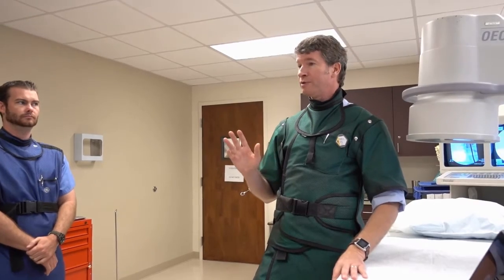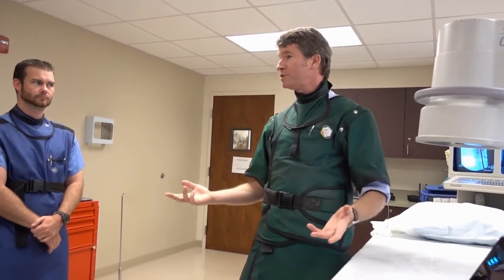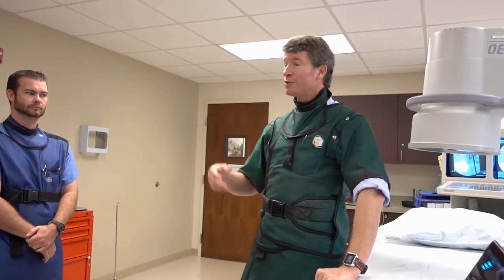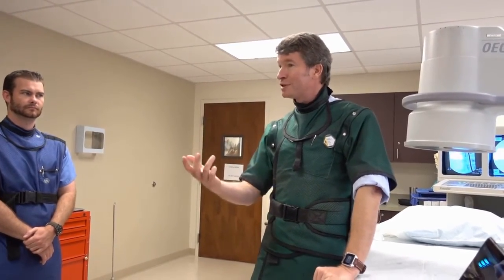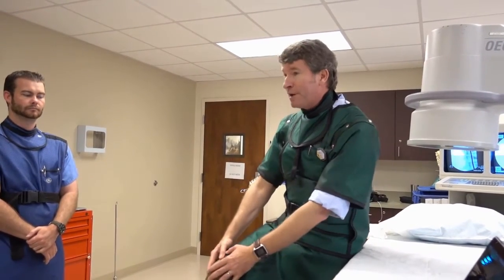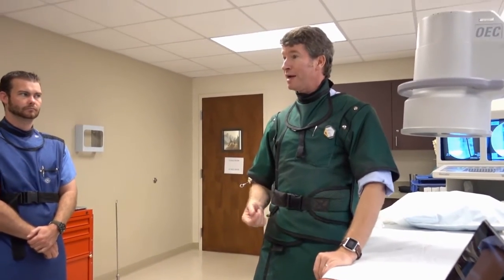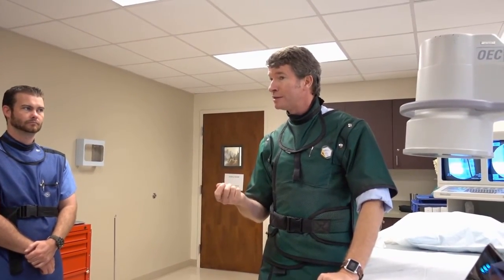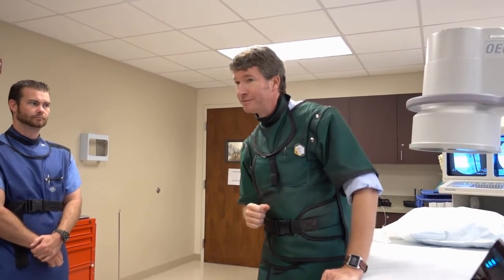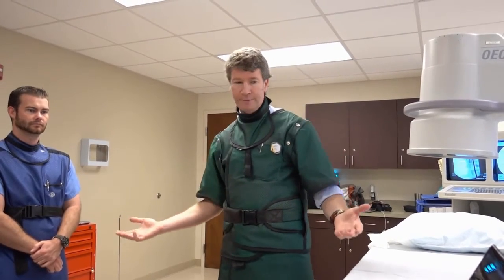There's a fascinating paper that was done about maybe 15 years ago, on orthopedists who generally think themselves to be really good at doing knee injections, right? So they gave the syringe and the needle to the orthopod. They did it blind, they palpated, scrubbed the knee, and then they took an x-ray of the contrast that they'd injected. 30 to 40% of the time, they weren't in the joint, which is pretty shocking when you think about it. You think, yeah, that's got to be the easiest thing to do.